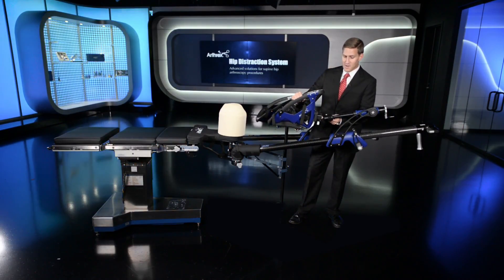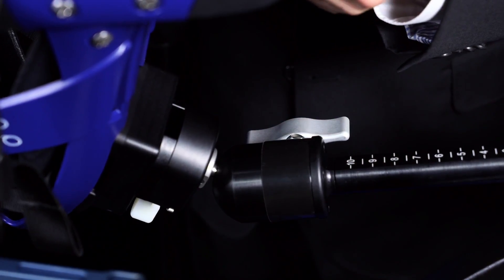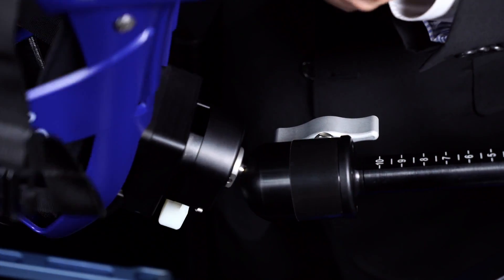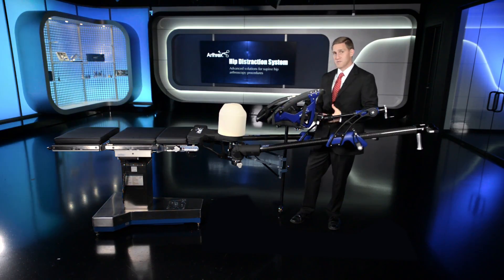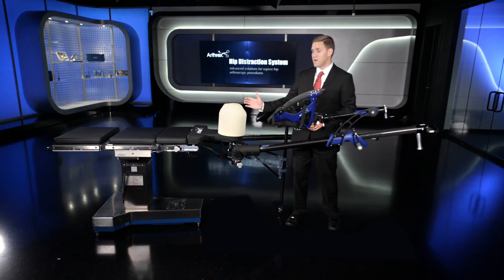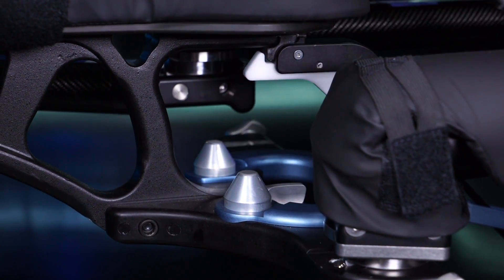The boot can be manipulated by unlocking this lever here on the inner portion of the spar for your manipulation of the foot into external and internal rotation as well as plantar flexion and dorsiflexion. Additionally, for your range of motion check, your perineal post and pad can be easily detached during the procedure to do a range of motion check after your cam decompression.